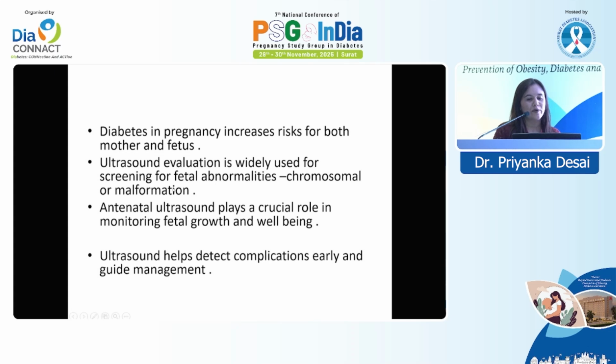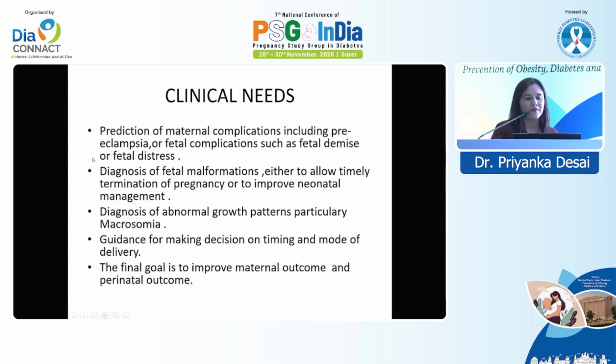Ultrasound evaluation is widely used for screening for fetal abnormalities, whether chromosomal or malformation. So antenatal ultrasound plays a crucial role in monitoring of fetal growth and well-being, and it helps detect complications early and guiding management. So what are the clinical needs for scans?